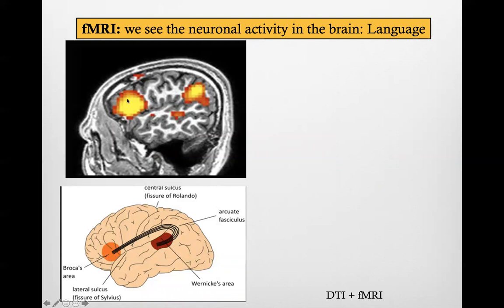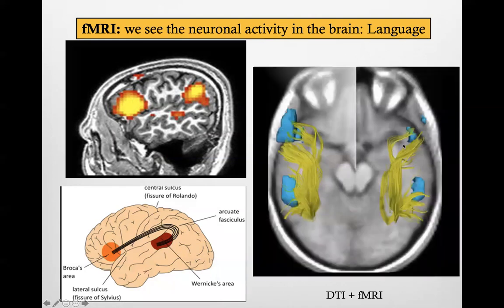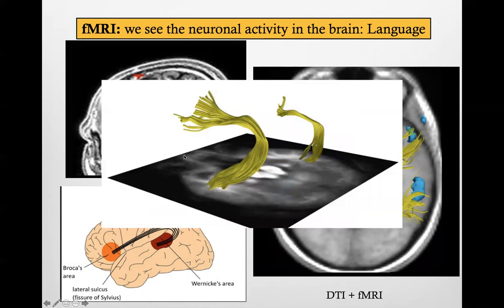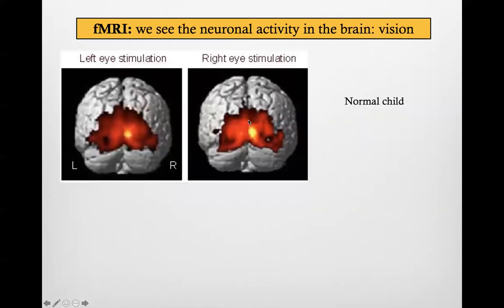Functional MRI picks up the areas of activation of the cortex, while DTI shows the bundle of white matter connecting Broca and Wernicke — this is the arcuate fasciculus in the axial projection demonstrated on DTI. In 3D, of course, the left arcuate fasciculus is bigger than the right. The same can be done with visual activity: left eye stimulation, right eye stimulation in a normal child activate the occipital lobes, which control vision.